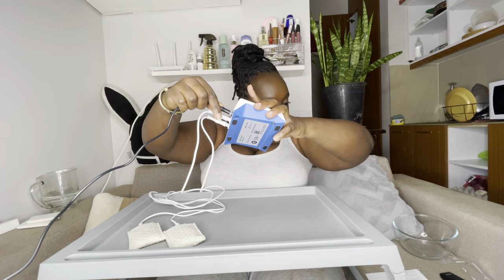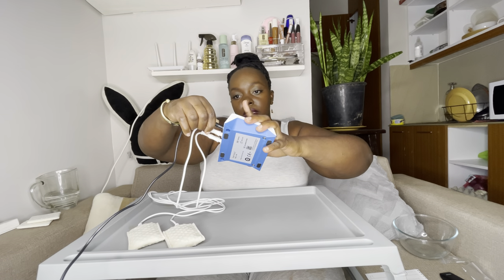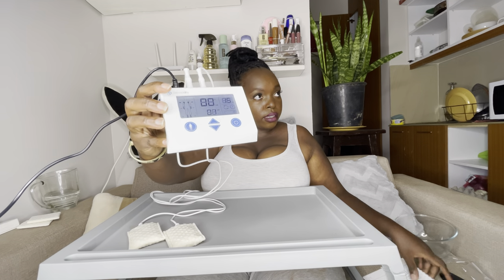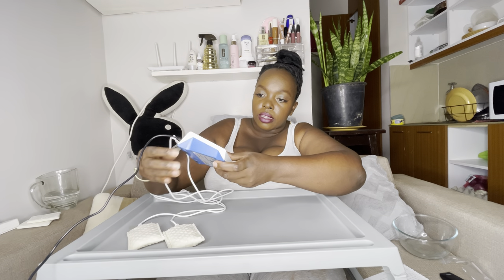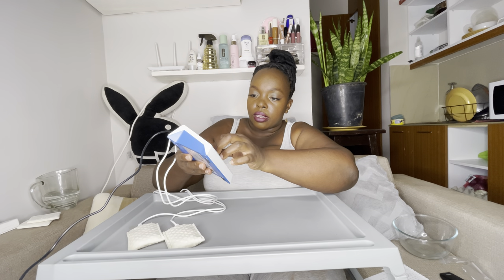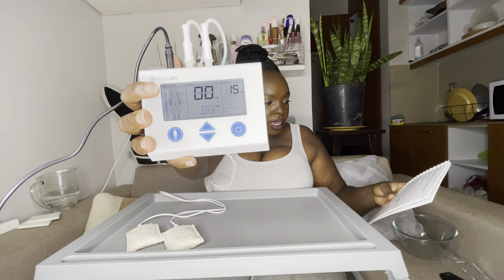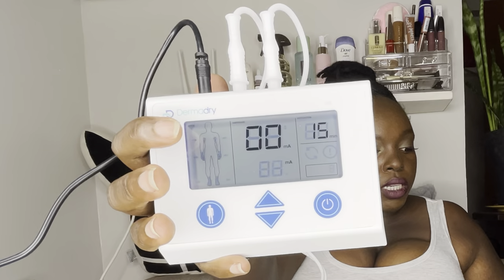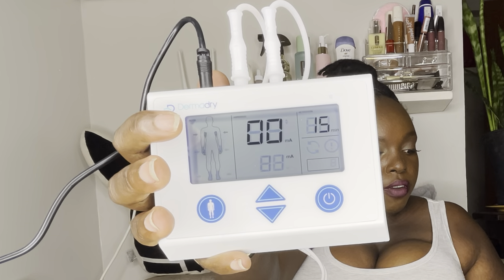Place the controller on the adapter. The controller's display will light up and start its automatic internal testing — all the display symbols and the green LED will flash. The internal testing takes one to two seconds to complete. The device will then switch to settings mode. The default treatment profile is set for treatment of the underarms.